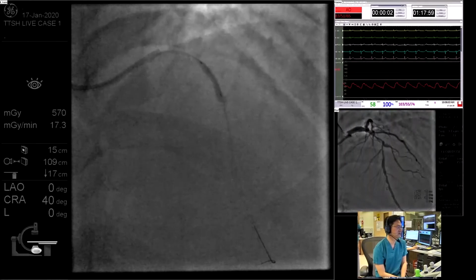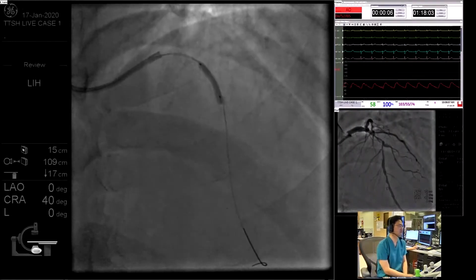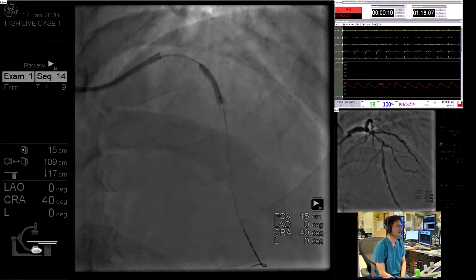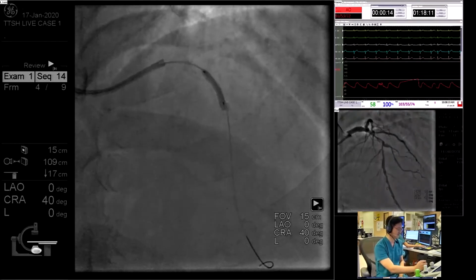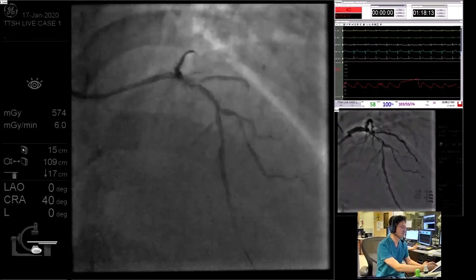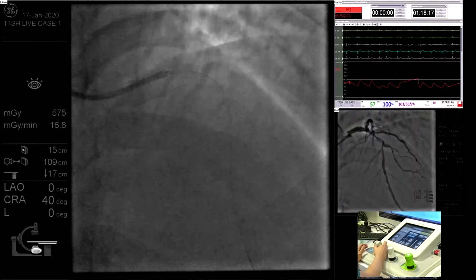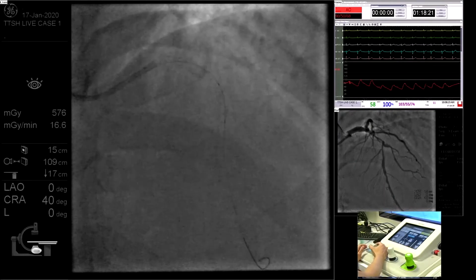Yeah, 1.5. Paul, when you see this napkin ring of calcium, concentric calcium, do you think a shock wave is a good solution to this? Yes, and shock wave is compatible with this. Yes, that's right. We tried it. I think we were probably the first anywhere, the opportunity happened, and we just did it.